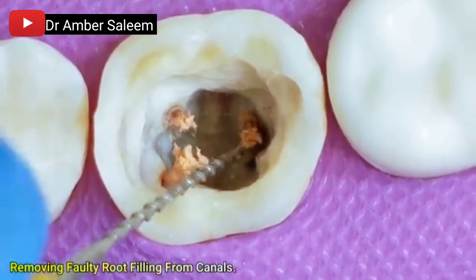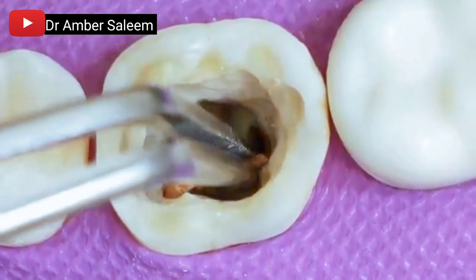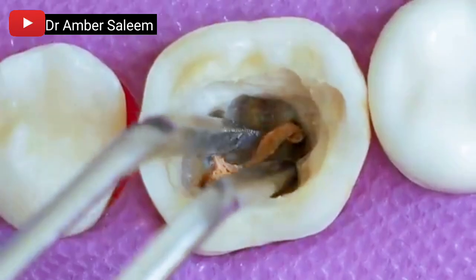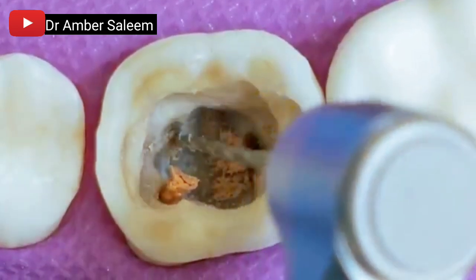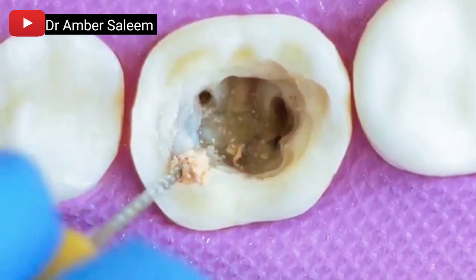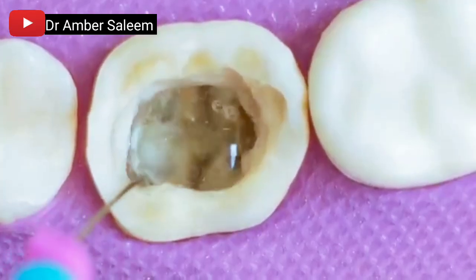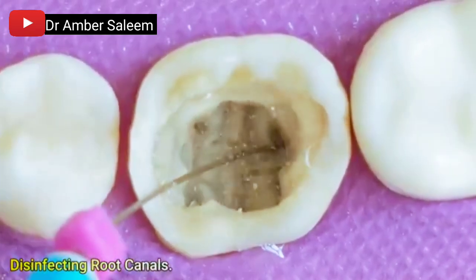Removing old root filling material from the canals. The existing gutta-percha and root canal filling are retrieved. Root canals are then disinfected to eliminate bacteria and debris.